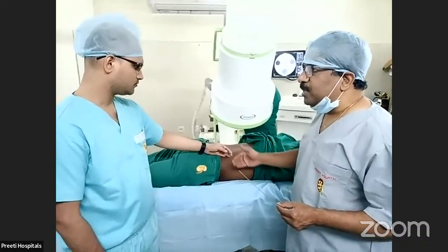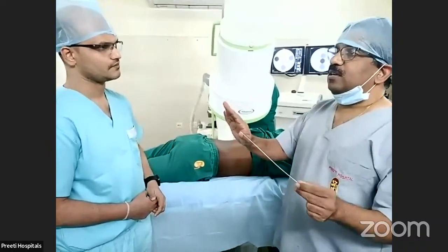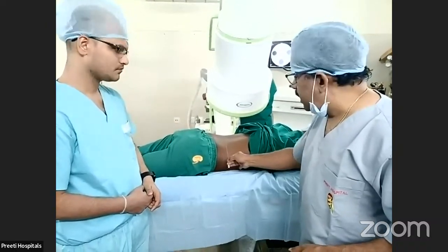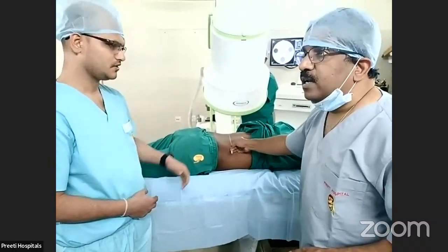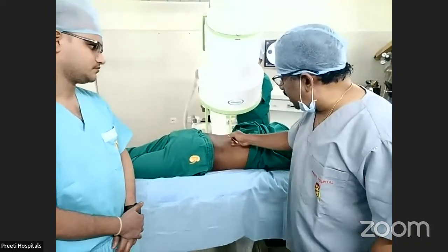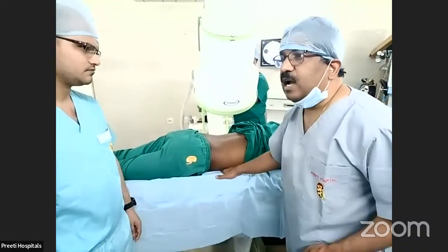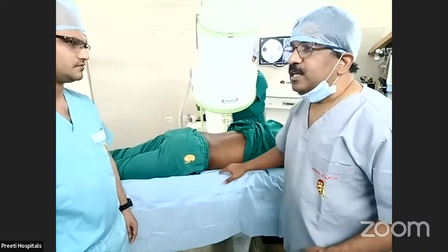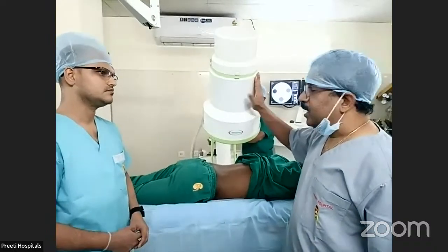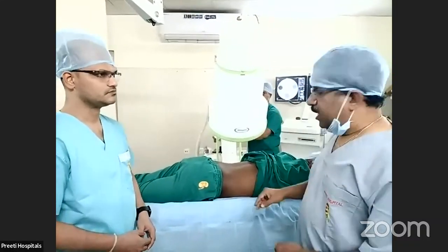Will it go away from the spine or towards the spine? It will go towards the spine. If the needle is going towards the spine, it is more superficial, that means more posterior. If the needle goes away from the spine, you are on the anterior side. So in prone PCNL, the C-arm is tilted 30 degrees, upper end towards the surgeon.